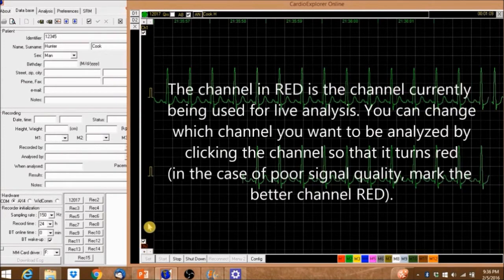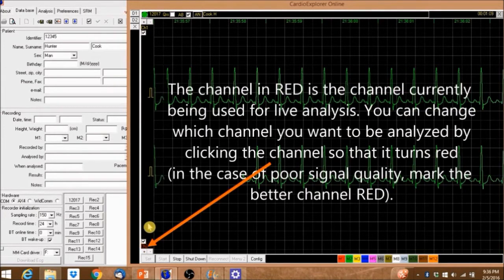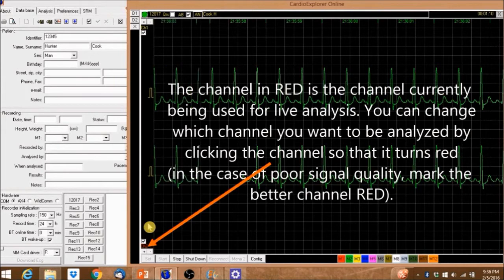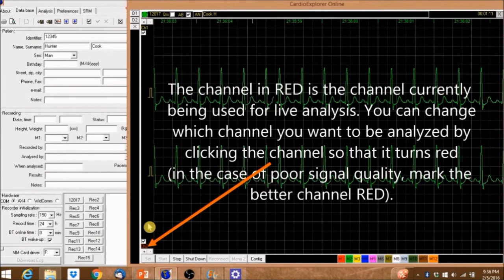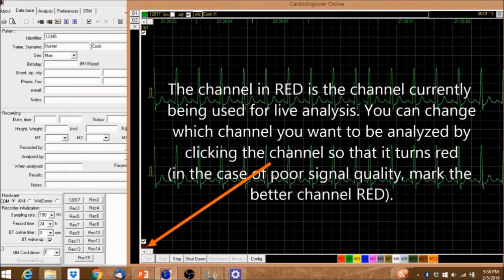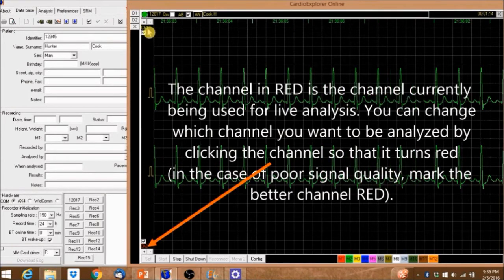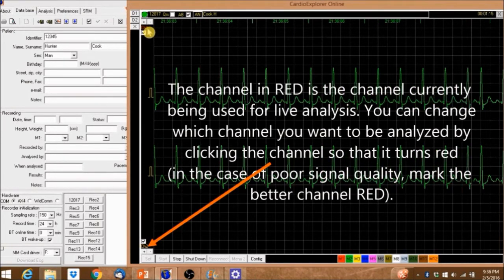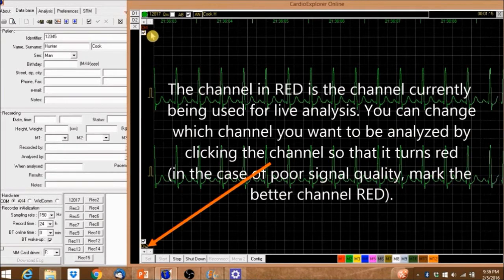The channel in red is the channel currently being used for live analysis. You can change which channel you want to be analyzed by clicking the channel so that it turns red. In the case of poor signal quality, mark the better channel red.